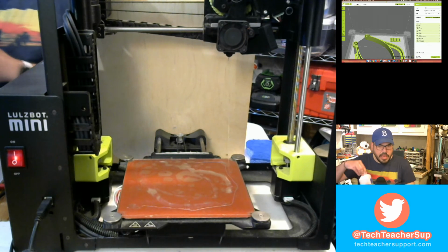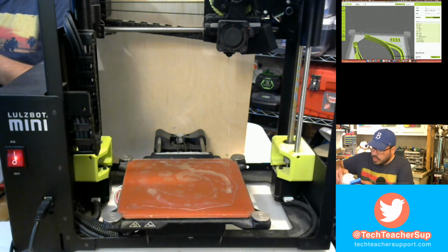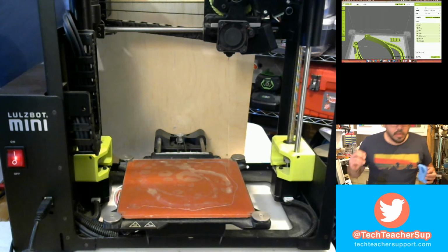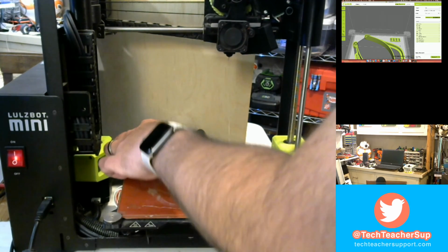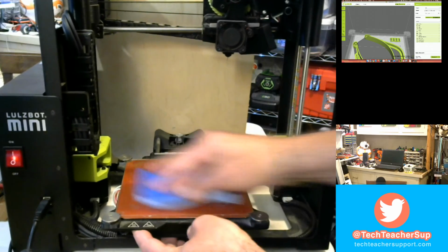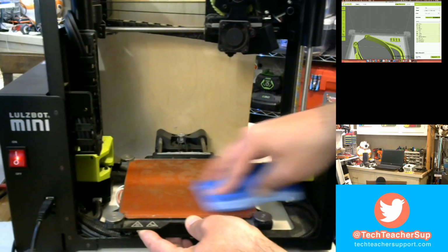What I use for that is this isopropyl alcohol and this Scotch-Brite sponge. So let's put a little bit of alcohol on the tip. And again, I just use a little bit, and I'm going to scrub that plate down of this 3D printer. As you can see, there's a little bit of plastic left over on there. I'm just going to give it a nice little wash here to make sure that there's no residue or leftover plastic on it.